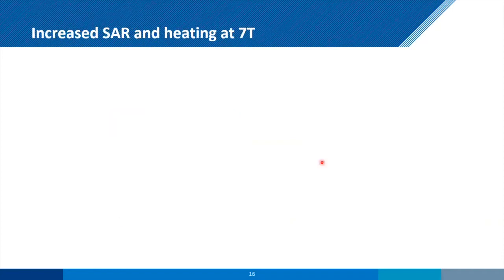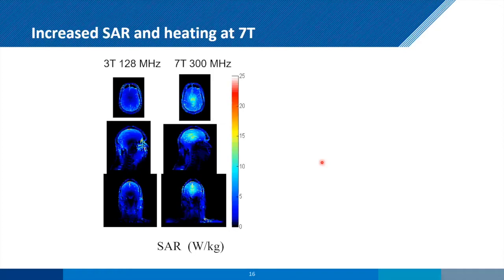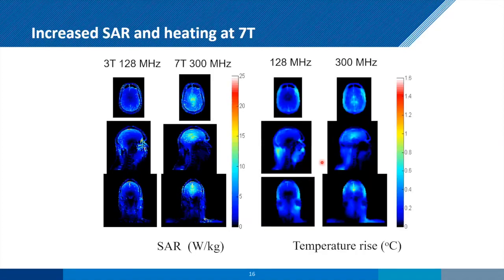Increased SAR, heating at 7T compared to 3T or 1.5, is not just increased, but also the spatial distribution, of course, is very difficult to tell. And so this is work, of course, by Chris Collins here. And again, if you're at 3T, then things act sort of the way you expect. Your electric field is going to be 0 in the middle because you've got a very symmetric structure. If you're driving with a birdcage, you know where the heating is going to be. That goes out the window when you start looking at 7T here. So you can get hotspots in different places.